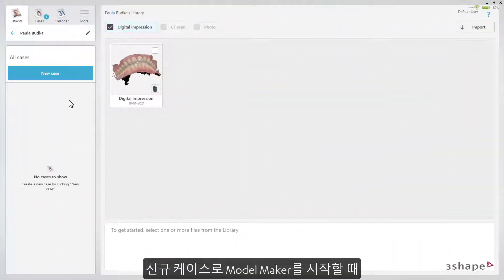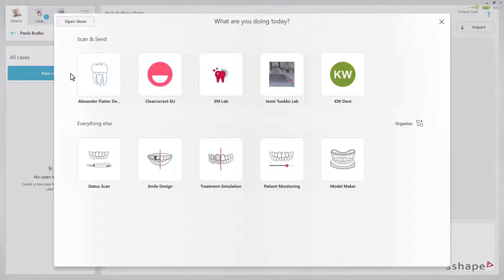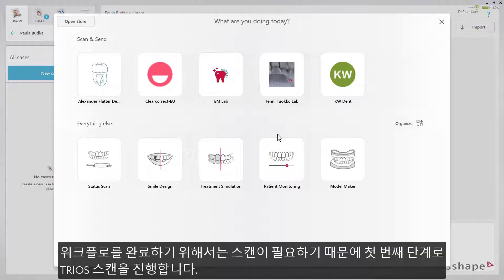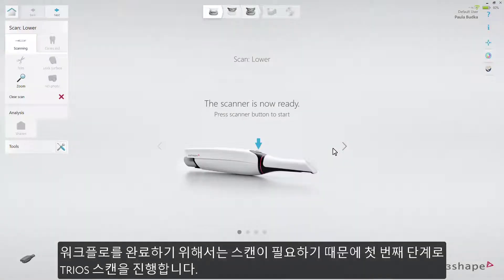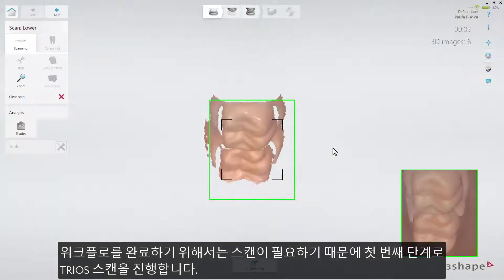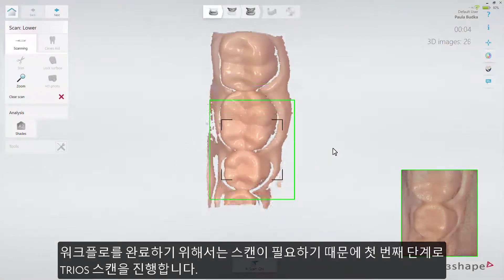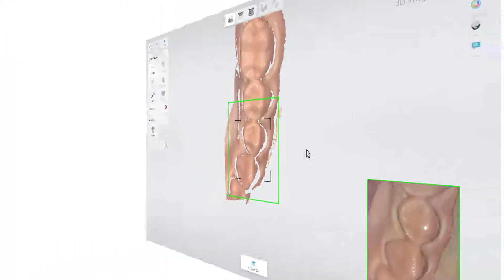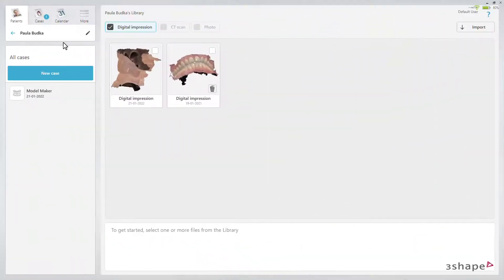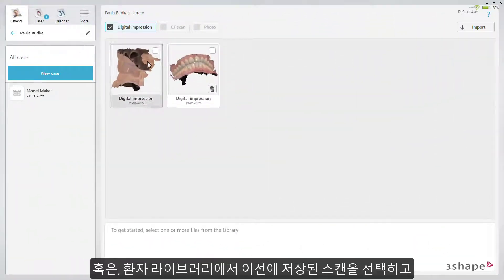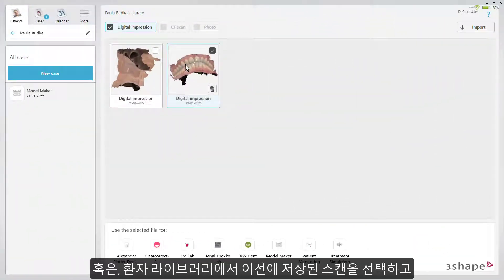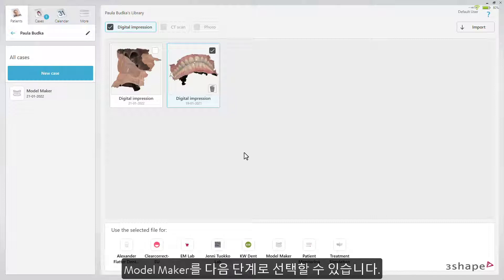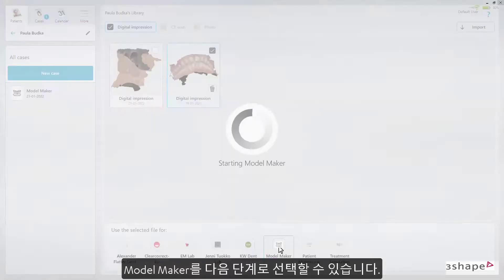When starting ModelMaker as a new case, a Trio scan will be the first step, as you need a scan set to complete this workflow. You can also choose previously performed scans from the patient library and select ModelMaker as a follow-up action.